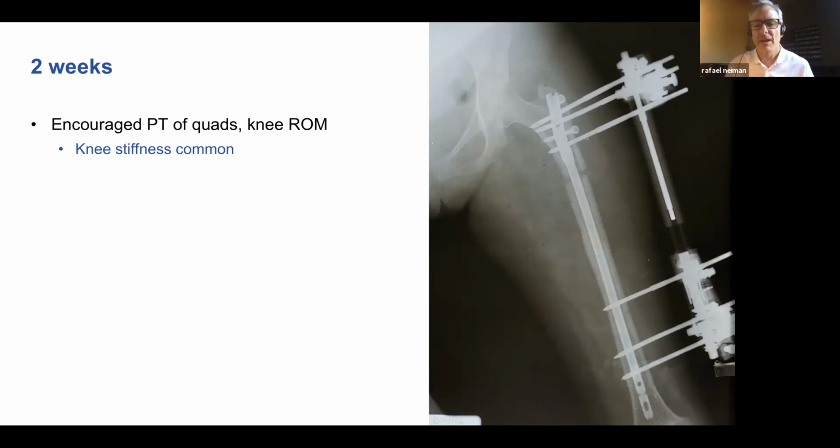Make sure it's as far away from the nail and still in good bone. So you place a pin first and then you drill over it with a cannulated drill bit. I did that in this case, just to try to maximize the space. One of these pins ended up still contacting directly against the nail, but that's how I would do it: be as precise as you can in trying to separate the pins from the nail.